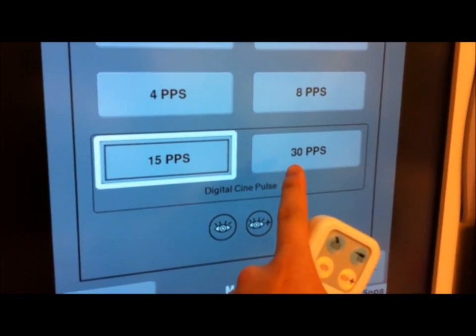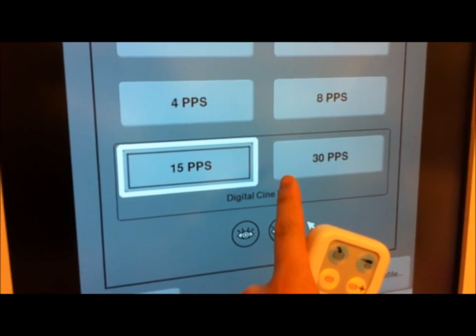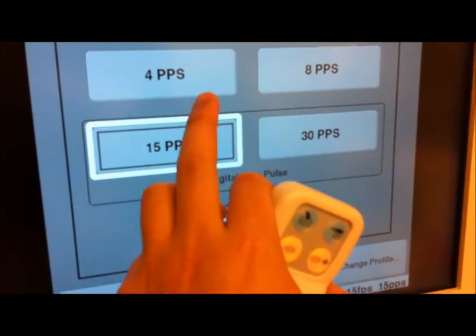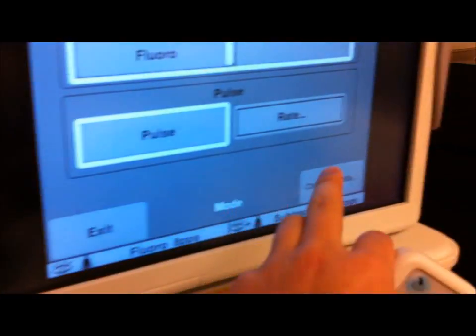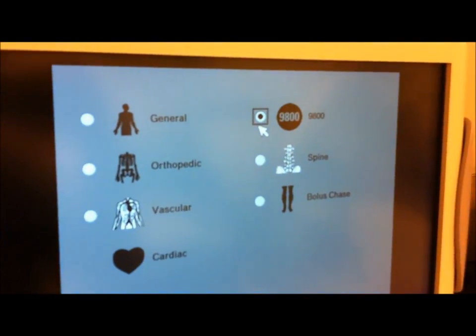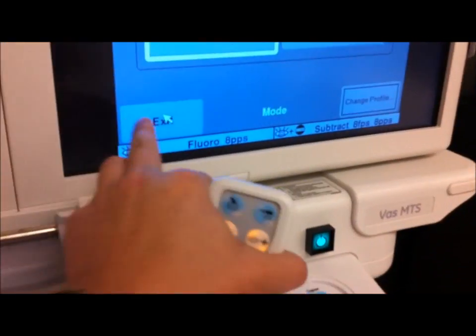Let's go back to rate. Or 30 frames a second — this will create a lot of frames and it will basically use up a lot more memory than normal. But let's go back to eight pulses per second. And if you need to change the profile — let's say I want to go back and I prefer the look of the 9800 OEC — you can hit that and hit OK. And let's exit.